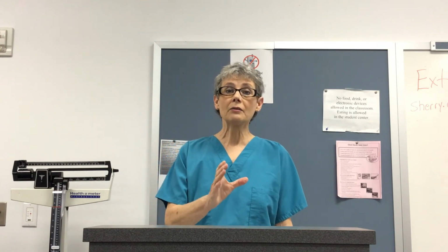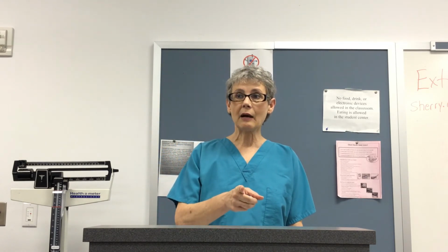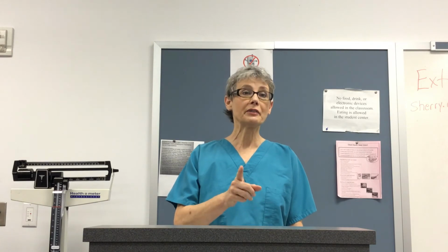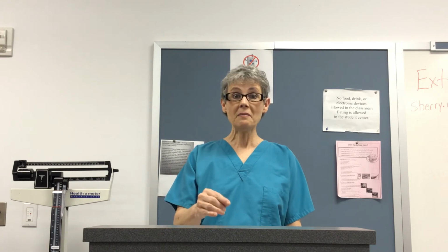However, I will tell you, in practice, some doctors, when they want, say, 250, or I've even had one that was 500 mils, they may want to get some fluid very quickly into the patient, and they will say to you, run this, I want an IV bolus of 250 mils of saline. And what they mean is they want you to have that go into that patient as quickly as it will go.